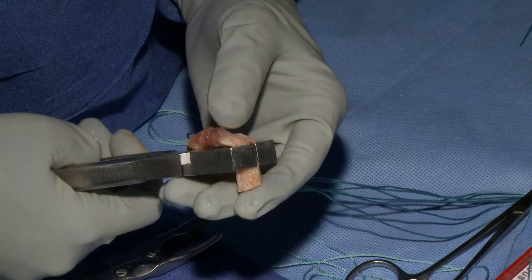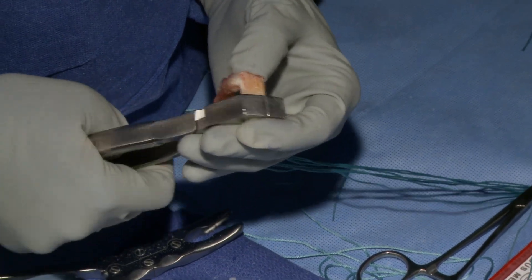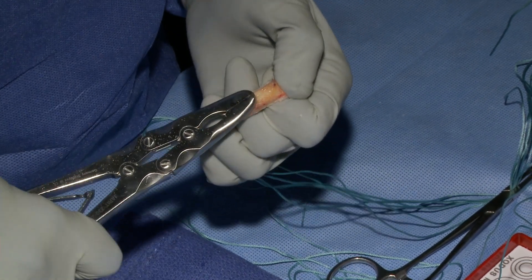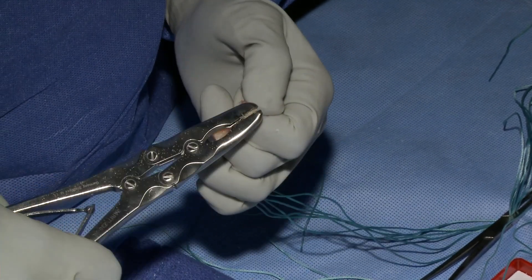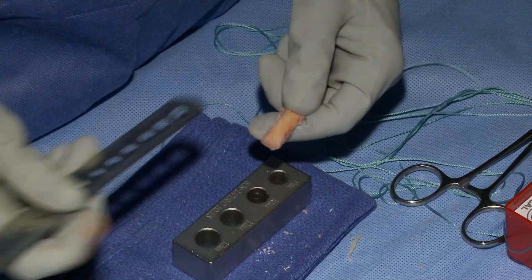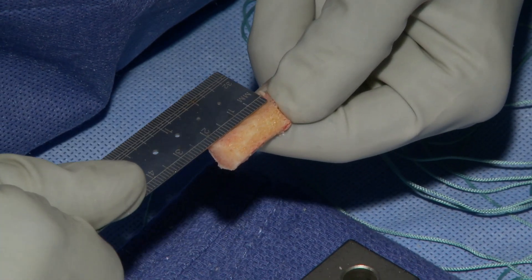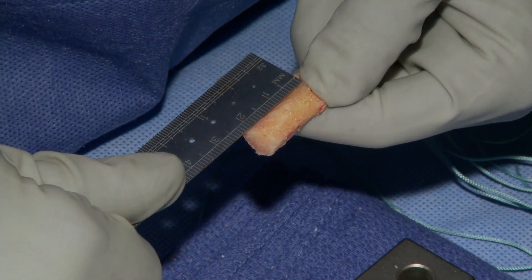The main reason for flipping the graft is because the tibial plug actually has a little extra step-off at the very proximal end, which makes graft fixation easier with whatever screw the surgeon prefers to use.